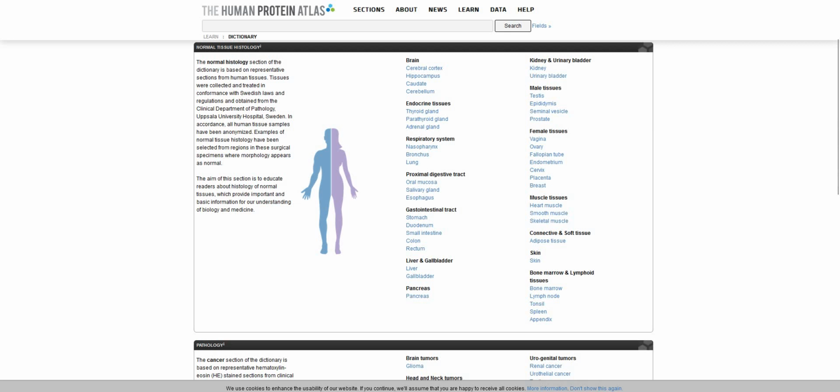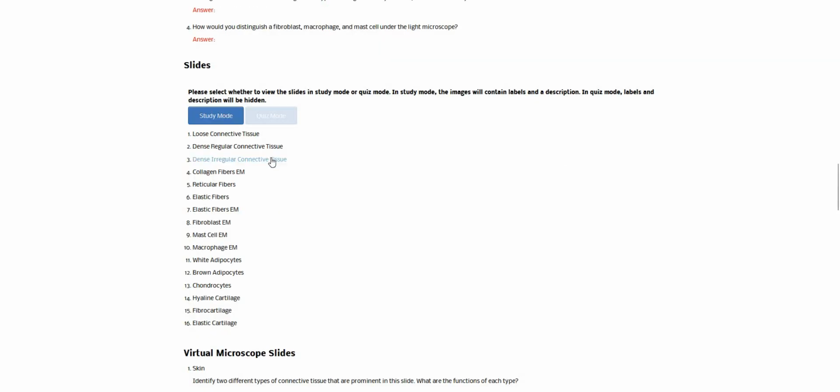All right, moving on. So that was all dense connective tissue. We're going to talk now about loose connective tissue. So loose refers to the way it's organized. So the fibers are a lot less tightly woven together, so to speak. The type of fibers we would find here are mainly collagen, but there's another type of fiber called reticular fibers. They're basically a thin collagen fiber.